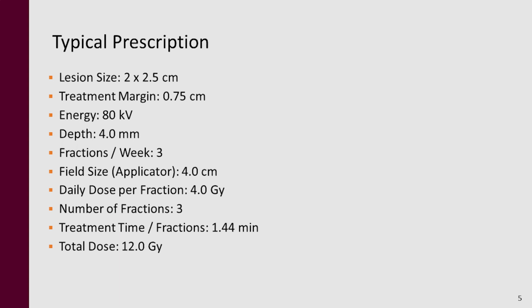If you don't have a machine and at some point you want to get one, Xstrahl folks are nice at giving you templates. They can't tell you exactly how to do things, but they can give you examples of what other people have done, people like me who over time have developed their own templates and built their own methods.